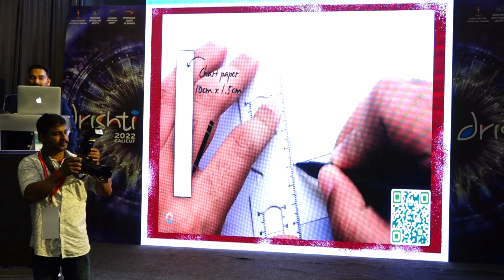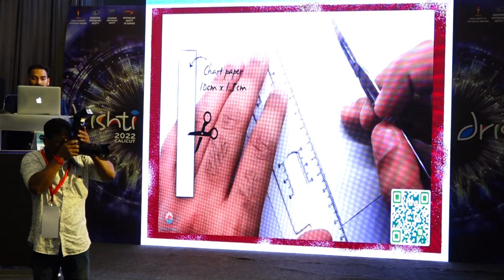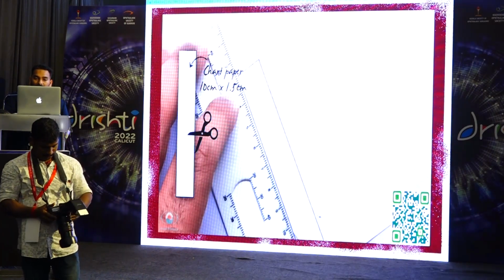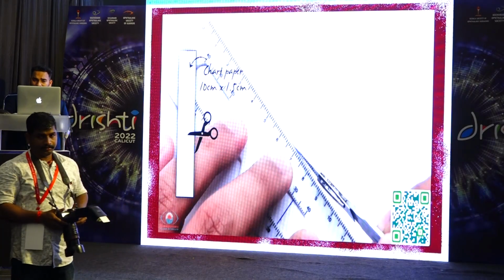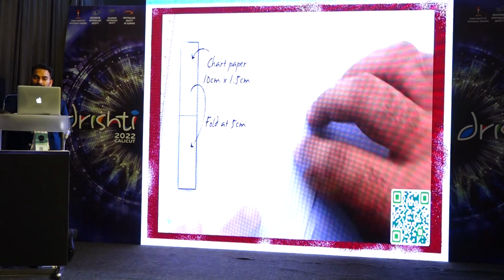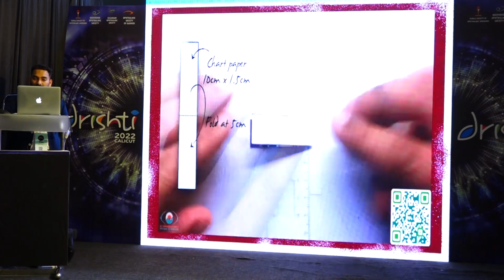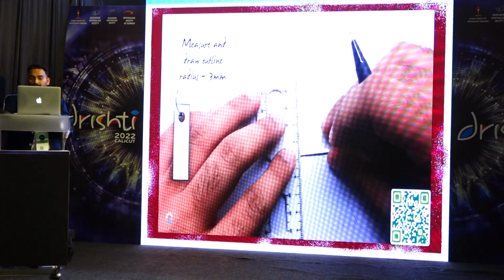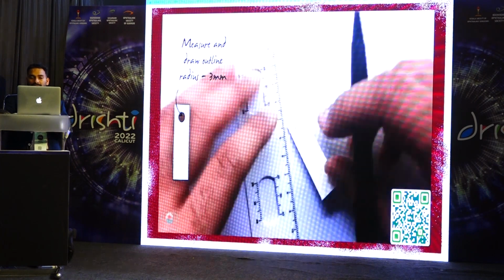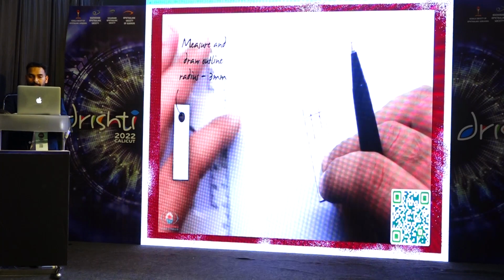The chart paper was then cut into 10 centimeters by 1.5 centimeters. Over here we'll attach a double-sided tape. Once you cut it out, make it into half, and you can fold it. Inside this portion, you're going to put the double-sided tape. Before that, we'll just mark a circle so that we make an opening for the intraocular lens to be kept.